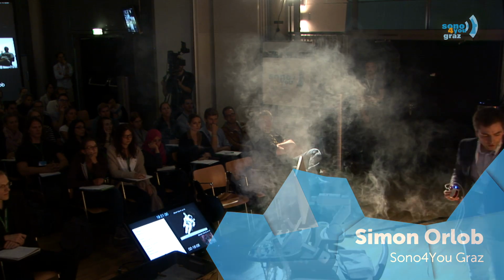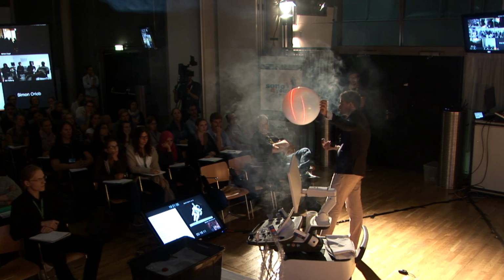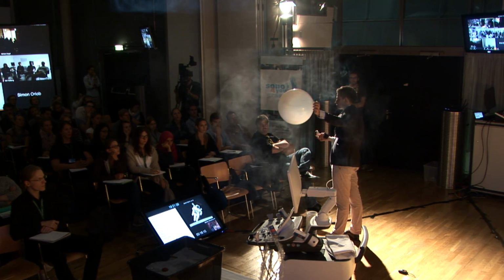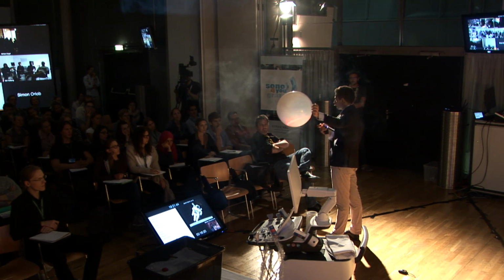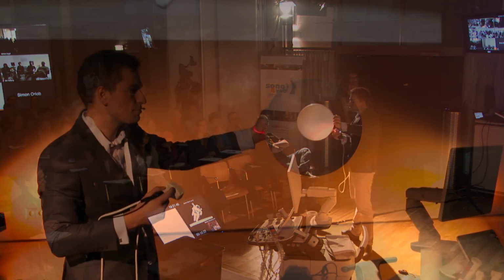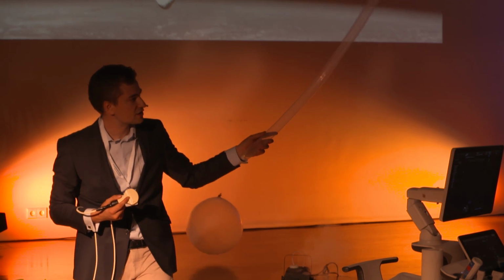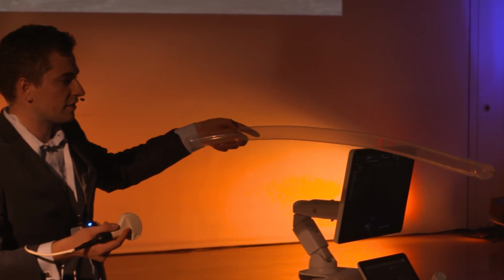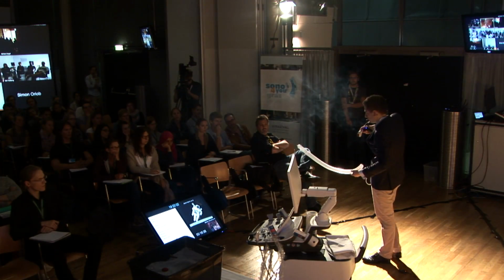But if you do an ultrasound exam, and let's face one structure, we're cross-sectioning this structure. And it's kind of easy if it's a big balloon, because I will always hit it. It's no problem at all. But it's a little bit different if I have some structures like a vessel, a small, tiny vessel. Right now, I have it in this plane, and right now I would like to see it completely longitudinal. Can you all see it in the audience?